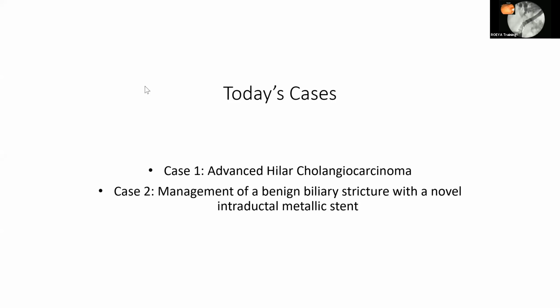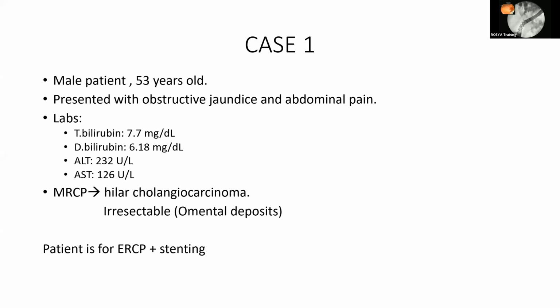Hello, everyone. So today we will have two cases. The first case is advanced hilar cholangiocarcinoma, and the second case will be for management of a benign biliary stricture with a novel intraductal metallic stent.